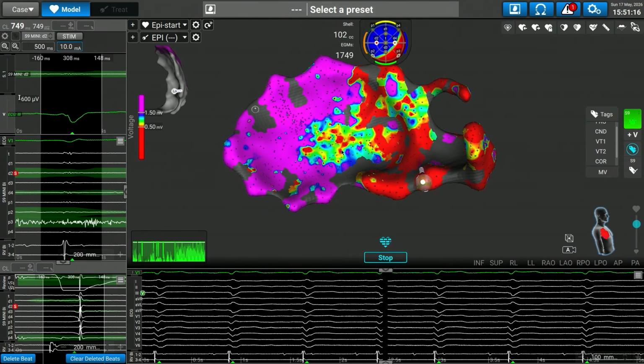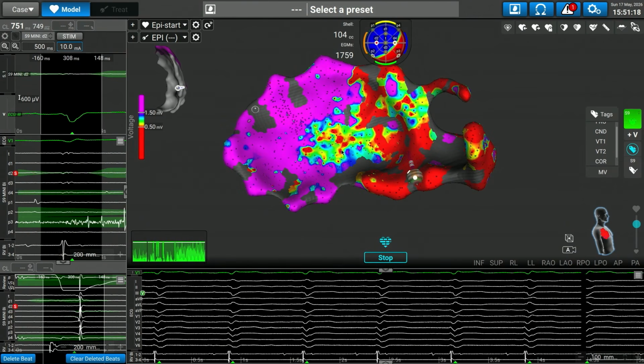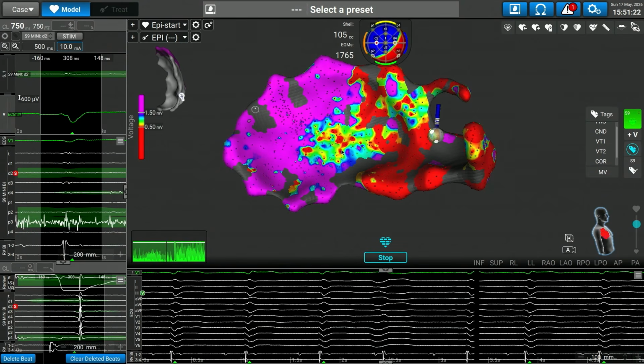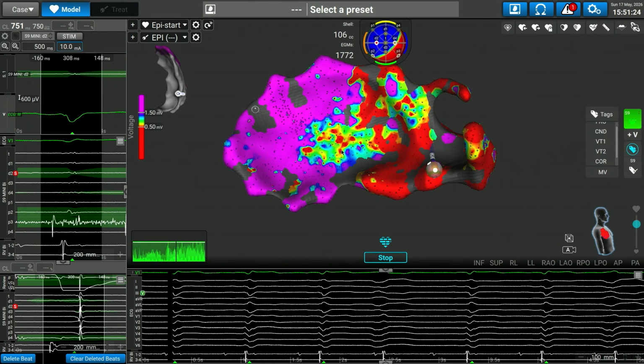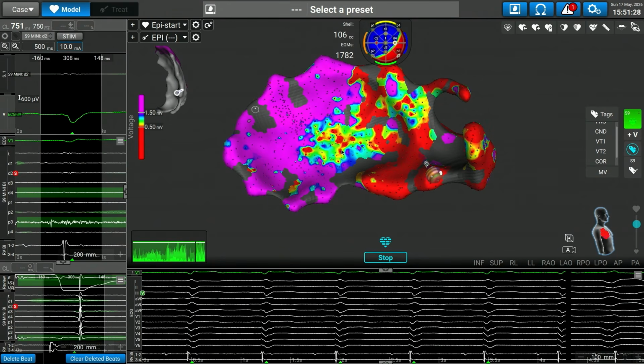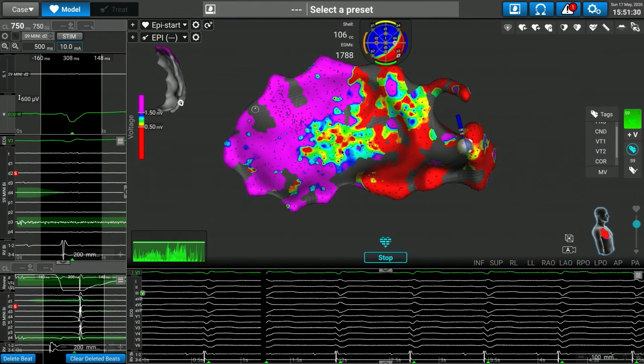Hey, Vivek and David, it's Andrea here. I just have a question, because I see you only use the voltage mapping. Are you looking at the signals, at least manually tagging the sites with interesting signals, or activation mapping, or these kinds of things, or not at all?